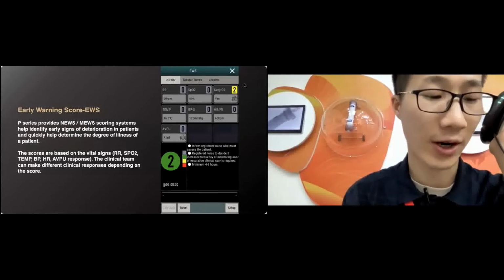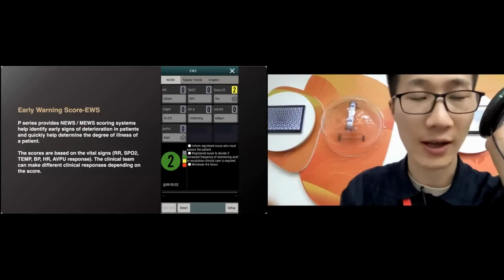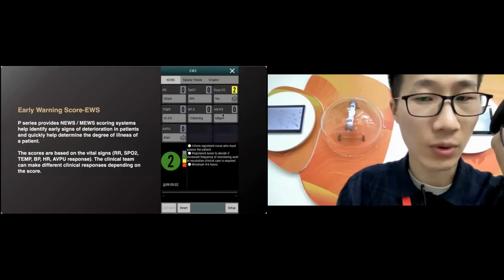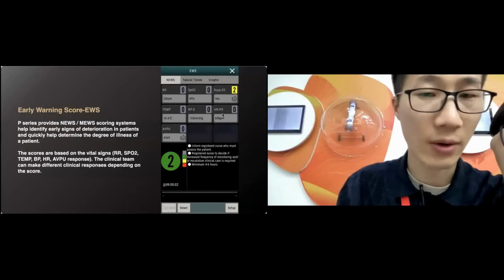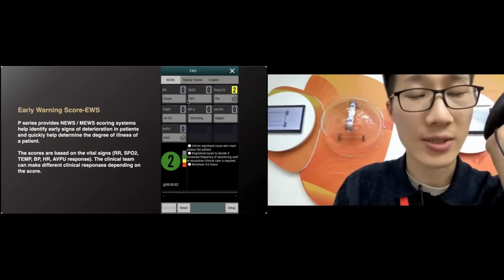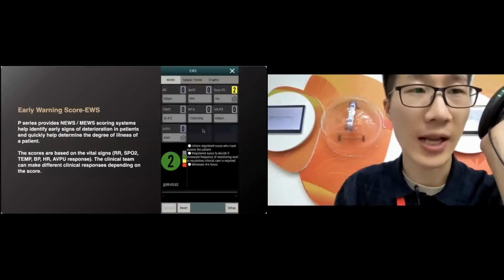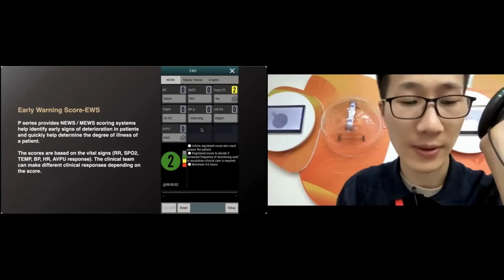That means when a parameter is out of range, the monitor is already alarming me. Why do I still need this EWS score as one of the things to be concerned about? Because an alarm to the users will only flag something like the SpO2 level, or heart rate. For healthy patients, probably only 1 or 2 parameters are out of range. But for critically ill patients, a lot of parameters are out of range, like respiration, where the patient is breathing fast or too low, or they can have abnormalities at the same time. I can't base only on the alarms, because we have high-priority alarms, moderate alarms, too many alarms for me.